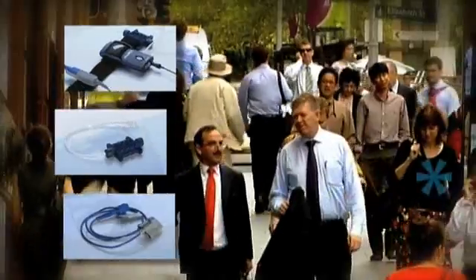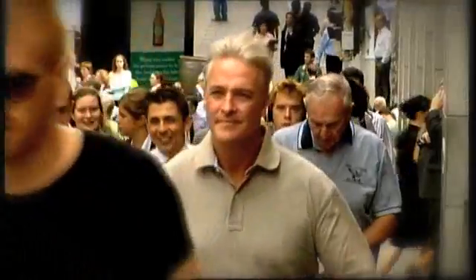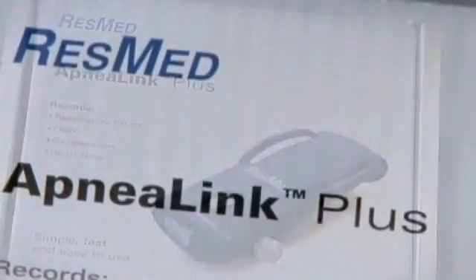A device that is unobtrusive and easy to use, yet records and stores a wealth of highly relevant diagnostic information — ResMed's ApneaLink Plus with EasySense technology.